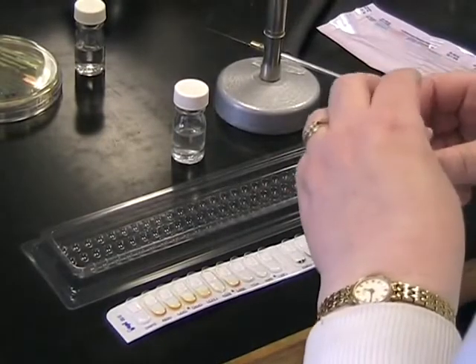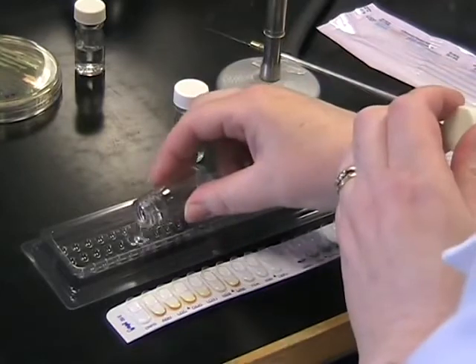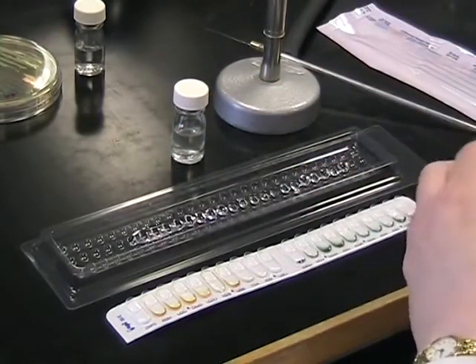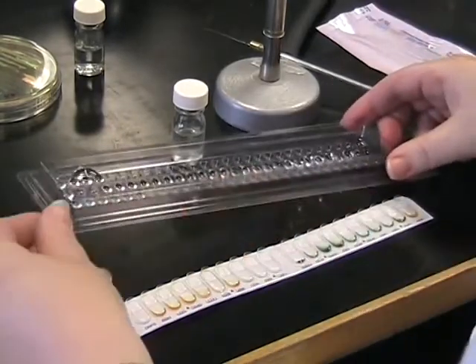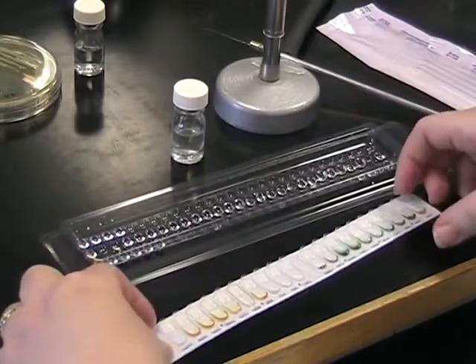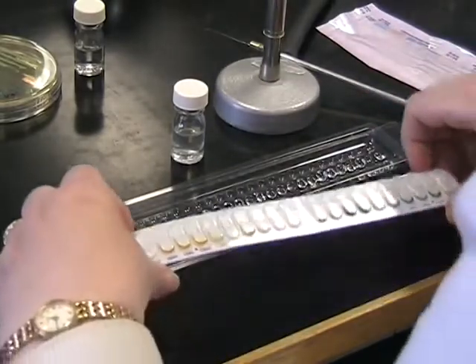We're now going to add 5ml of water into the little holes in the bottom of the tray. This stops the strip from drying out when it's incubated. When the water is dispersed, put the strip into the tray.